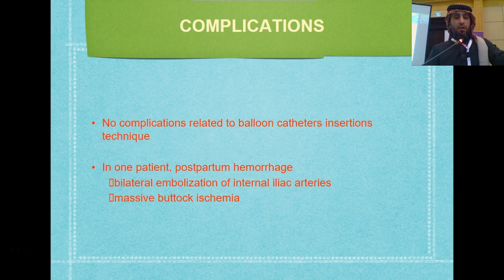We got only one complication in these 60 cases, but as I mentioned, after that we've had 2 complications, but not in those types of cases. A patient, because we had done embolization, got massive buttock ischemia. It's unusual, but for sure it could happen.